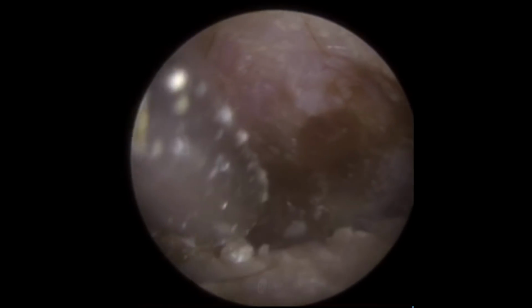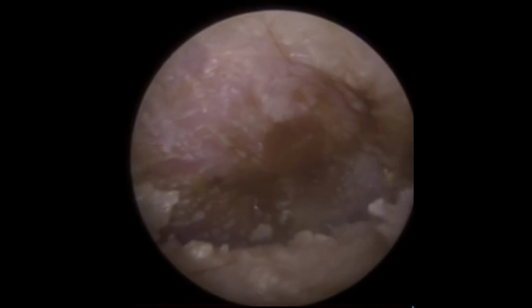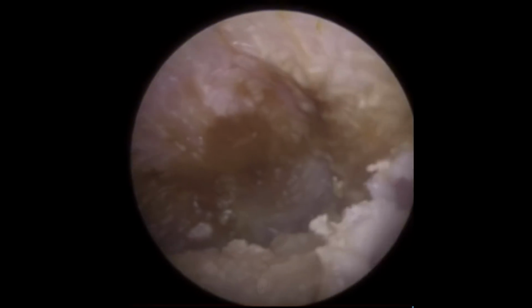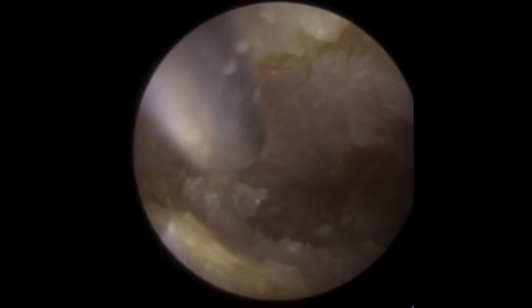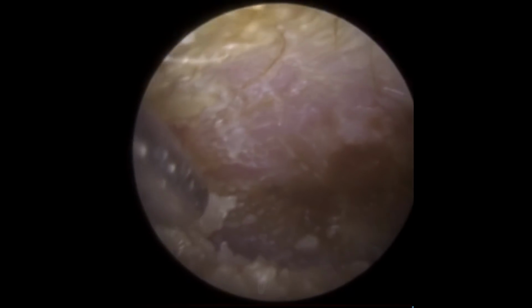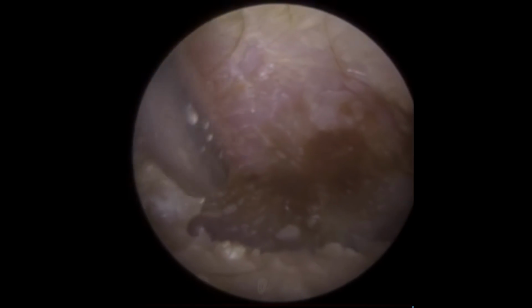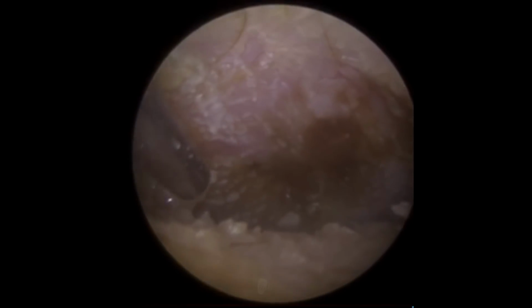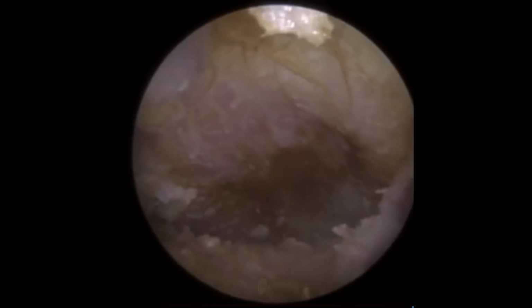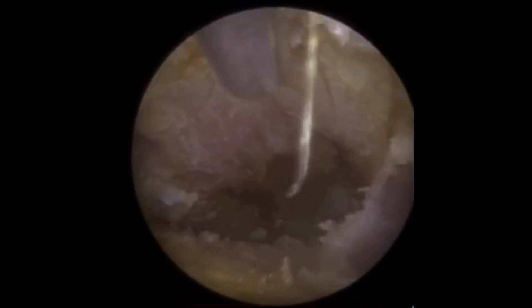It's a very tedious procedure in the sense where when you're peeling skin it can take a while. Because you're having to literally peel it segment by segment, unlike with wax where you can suck onto a large lump of wax and it comes out in a big mass. With skin it tears as you peel it, so you have to go back and get another layer. You can always compare it to, say you've got a cardboard box and an old delivery sticker on there and you're trying to peel the sticker off, and it tears away in little pieces. It's similar to that, so it's very tedious in that respect.